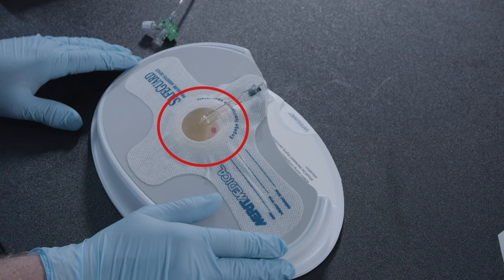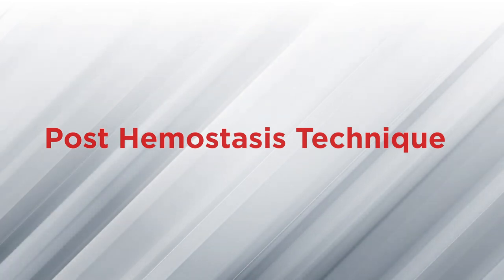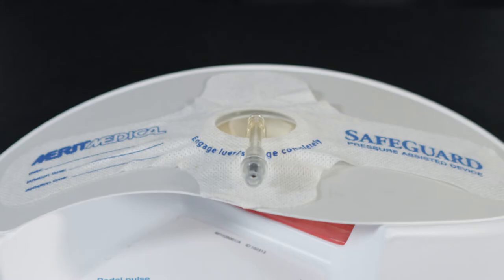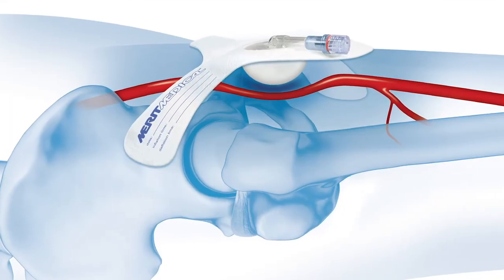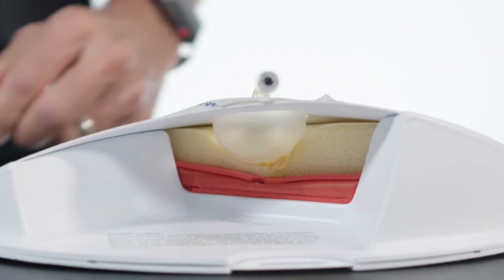Confirm hemostasis is achieved by viewing the site through the inflated bulb. For the post hemostasis technique, in which hemostasis has already been achieved and the sheath is removed, place the center of the balloon directly over the arteriotomy. Ensure that the inflation tube is in a location that is easily accessible to the clinician. Now pull one strap down, expose the adhesive to the skin, and apply, then do the same with the other side. Ensure that the band is snug and tight against the skin and that the balloon remains over the arteriotomy. Attach an appropriately sized luer locking syringe to the valve of the Safeguard device. Inflate the Safeguard device with air until hemostasis is achieved. The maximum fill volume is 40 ml. Check distal pulses to assure blood flow is maintained.